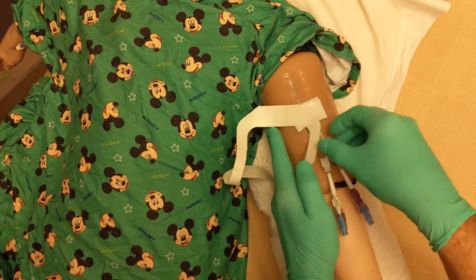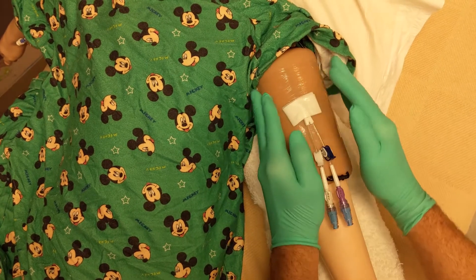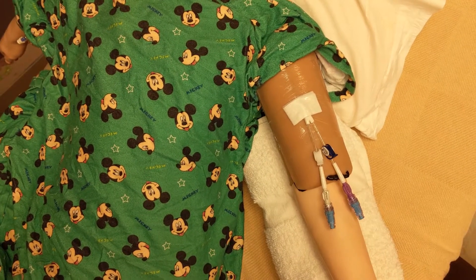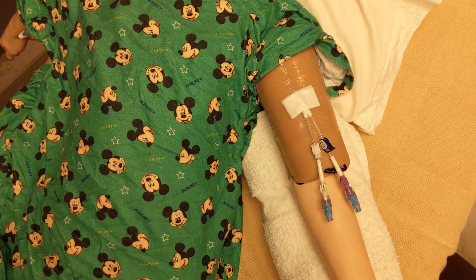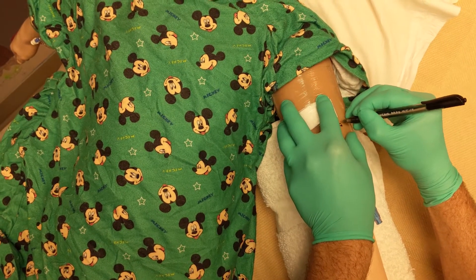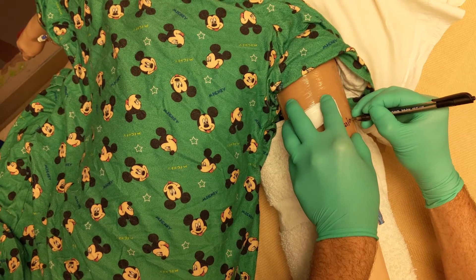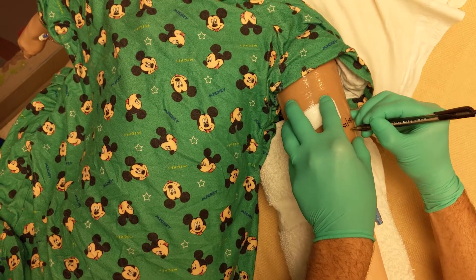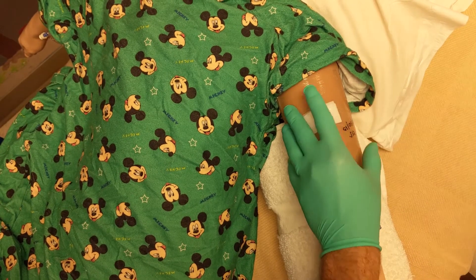It's best practice to take a marker and write the date that you've changed the dressing. It's recommended that we change dressings every seven days, or as needed if they get wet, start lifting, or become soiled for any other reason. It's important that you check your dressing each time you access or use the line to make sure it's clean, dry, and intact. Keeping that site clean and dry with a secure dressing is one of the best things we can do to prevent the line from getting infected.